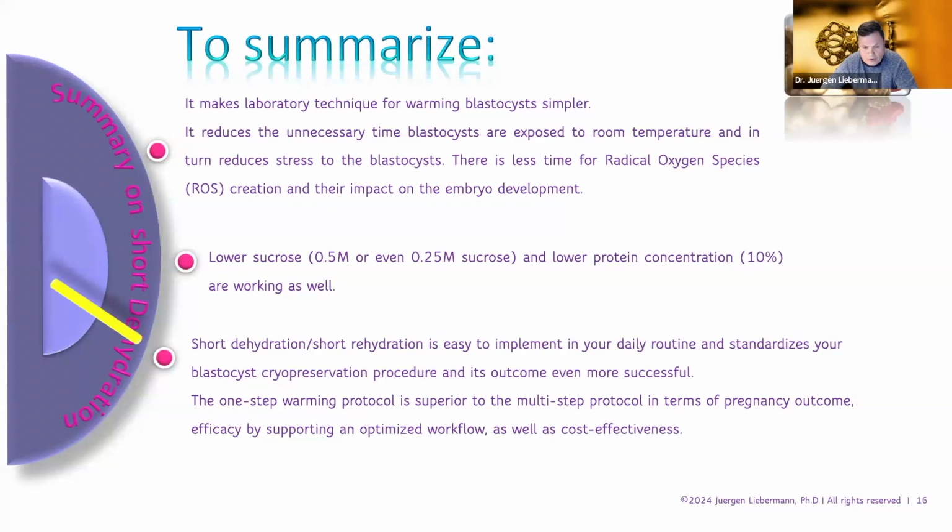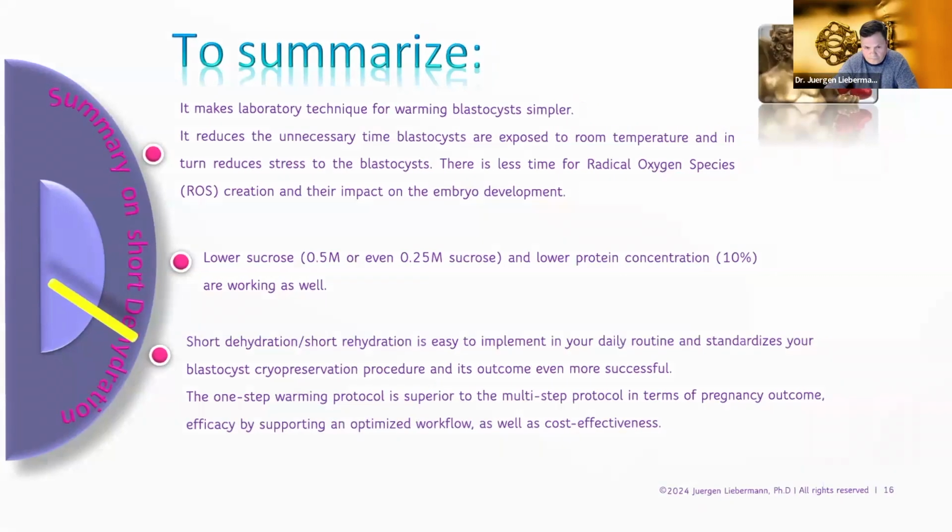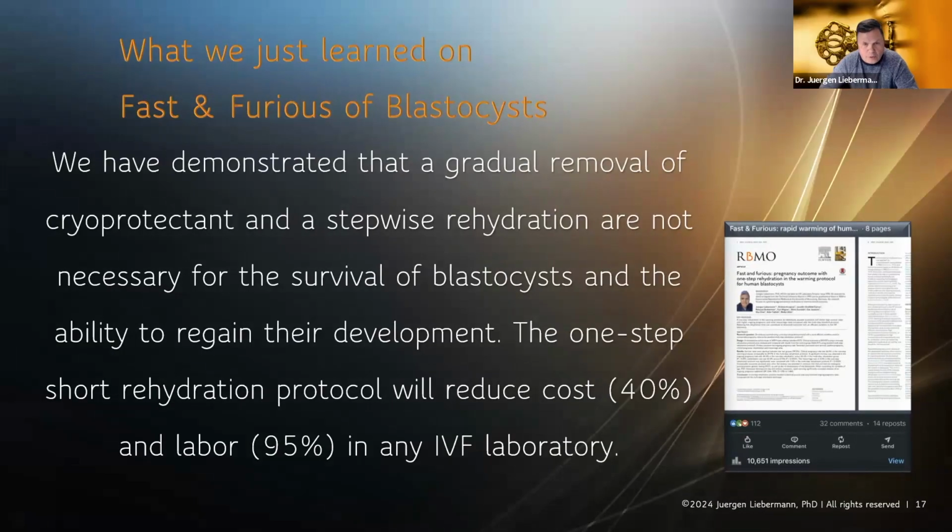The one-step warming protocol is superior to the multi-step protocol in terms of pregnancy outcome, efficacy by supporting an optimized workflow, as well as cost effectiveness. So what we just learned on Fast and Furious of blastocysts: we have demonstrated that a gradual removal of cryoprotectant and a stepwise rehydration are not necessary for the survival of blastocysts and their ability to regain their development. The one-step short rehydration protocol will reduce cost. We estimate about 40%, and labor of about 95%, in any IVF laboratory.